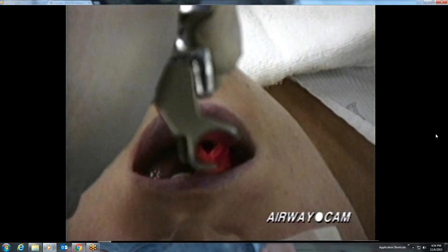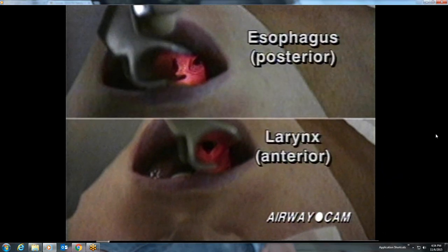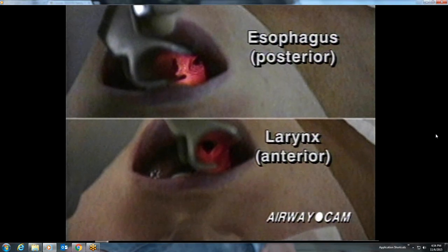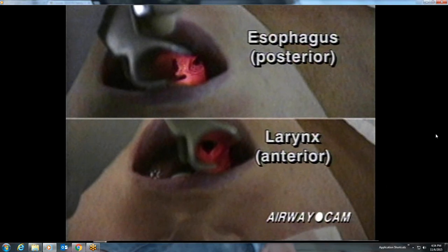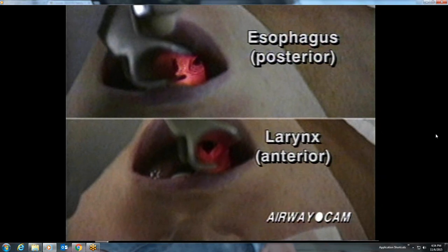Comparing the appearance of the esophagus and the larynx: the esophagus is very round and without any adjacent structures. Remember, the esophagus is posterior to or beneath the larynx. The larynx has a three-dimensional appearance due to the prominences of the posterior cartilages and the interarytenoid notch. Also note that the laryngoscope blade is away from the teeth and that the tongue is well controlled on the left side of the mouth.